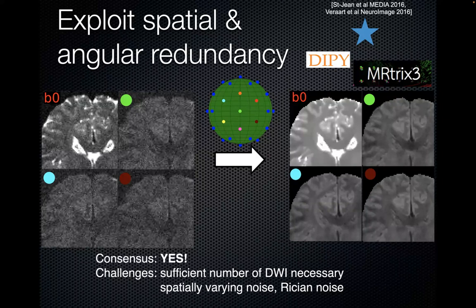So there are so many tools out there, but something that exploits structure, neighborhood spatially, but also angularly, to denoise without blurring the edges. So it's very nice now that we have strong tools to remove noise, and that makes us able to push the resolution. We can actually deal with noisier data than we used to and try to have smaller pixels here, because our denoising algorithms can sort of enhance SNR.